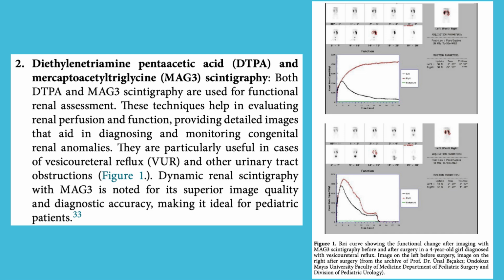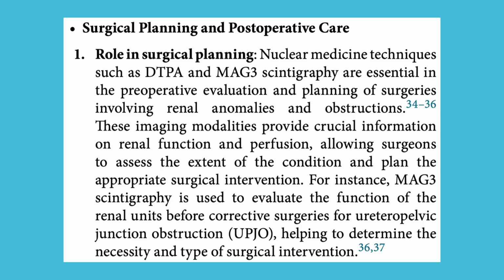Figure 1. Dynamic renal scintigraphy with MAG3 is noted for its superior image quality and diagnostic accuracy, making it ideal for pediatric patients. Surgical planning and postoperative care. 1. Role in surgical planning. Nuclear medicine techniques such as DTPA and MAG3 scintigraphy are essential in the preoperative evaluation and planning of surgeries involving renal anomalies and obstructions. These imaging modalities provide crucial information on renal function and perfusion, allowing surgeons to assess the extent of the condition and plan the appropriate surgical intervention.